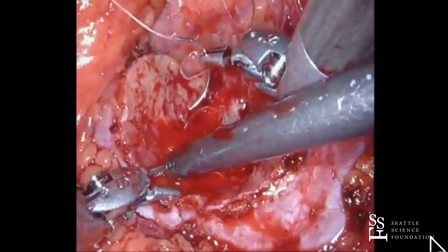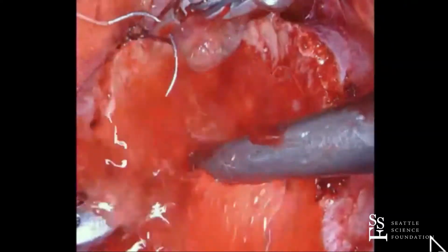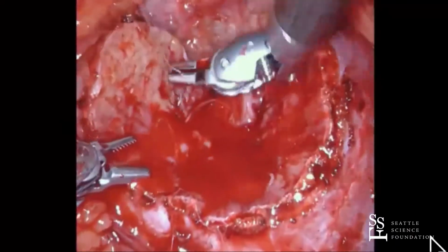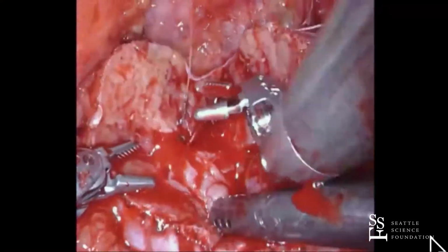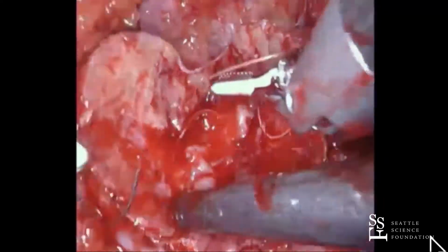Yeah, there's something right there. Give me a little irrigation, Brando. Irrigate right there. Yeah, right there. A little flush right there. Good, there it is. I mean, these are actually those little arcuate arteries right here. You can spend all day doing these, but I'm going to do this last vessel, and then we're going to do our normal closure.